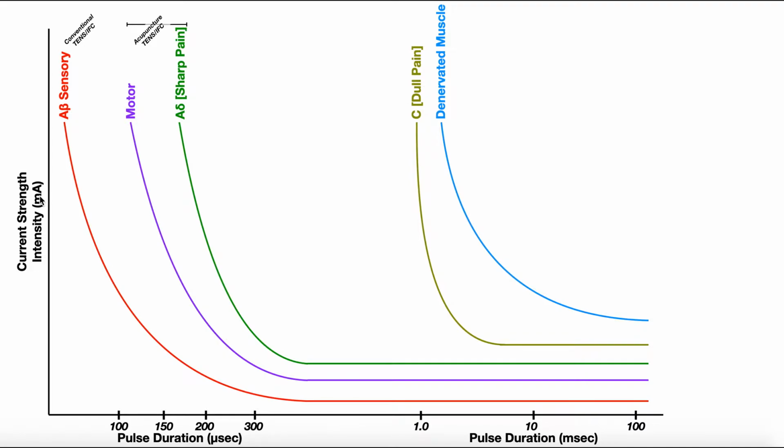And number two, that 10 of intensity on that particular machine, if you go to another company's machine or just a different machine in general, that intensity of 10 will not be the same as the intensity on the machine you were using. So intensity on most machines is not the number of milliamps, it's just an arbitrary number. And so that's how we're going to treat it on this graph. When we interpret this figure, we just pick an arbitrary intensity. We're not worried about how many milliamps this is because this is all conceptual right here.